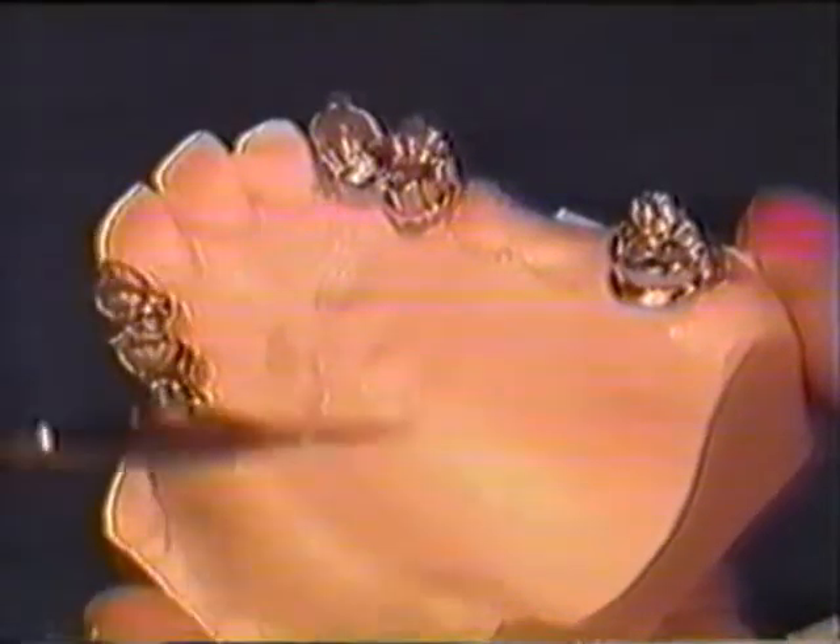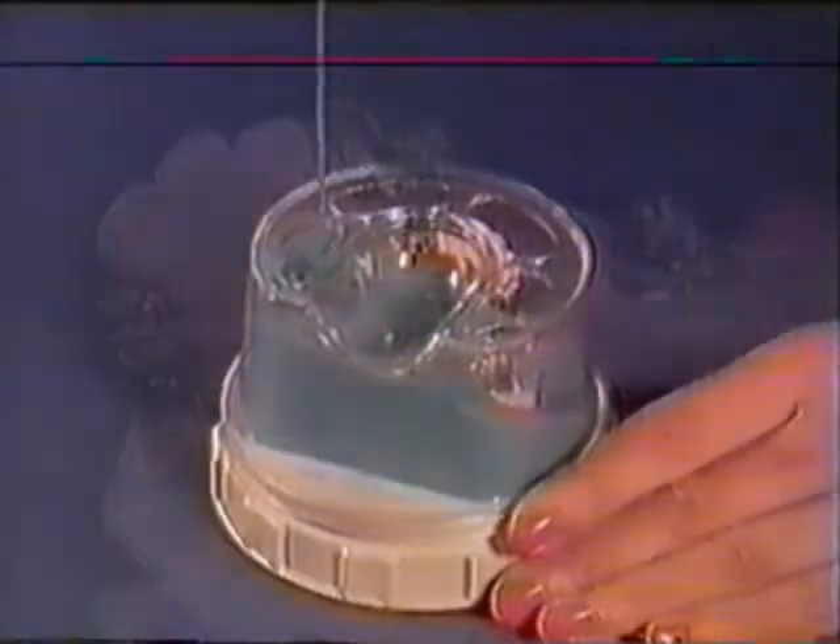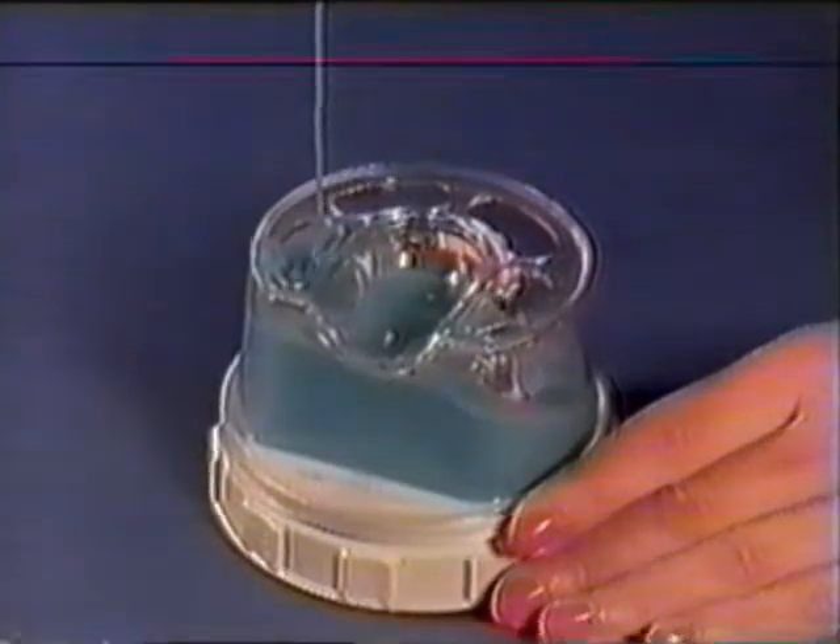Now the master model is prepared for duplication. Undercuts are carefully blocked out with thermowax. Duplication is carried out with a silicone material, such as REMA-SIL. After the silicone has set, remove the master model. Any crowns that don't remain in the duplicating flask can be repositioned easily.